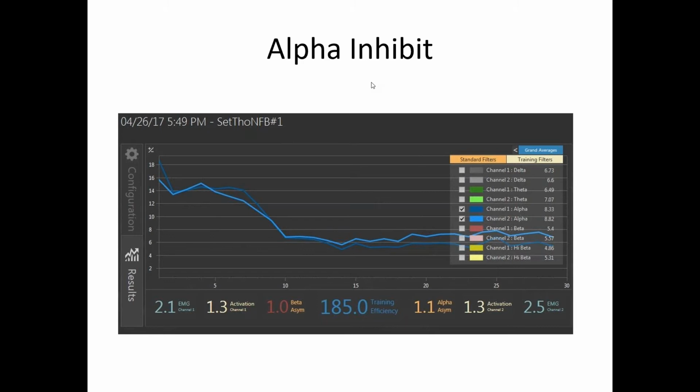that what you're seeing on our trend screen is in fact, without a doubt, and inarguably inviting the brain to move in a normative direction. And we believe that the brain prefers to move in a normative direction because it was designed to operate most efficiently there. It has a sense of survival. It wants to be there. But there have been mitigating circumstances that are preventing it from returning to its generally normative pattern.